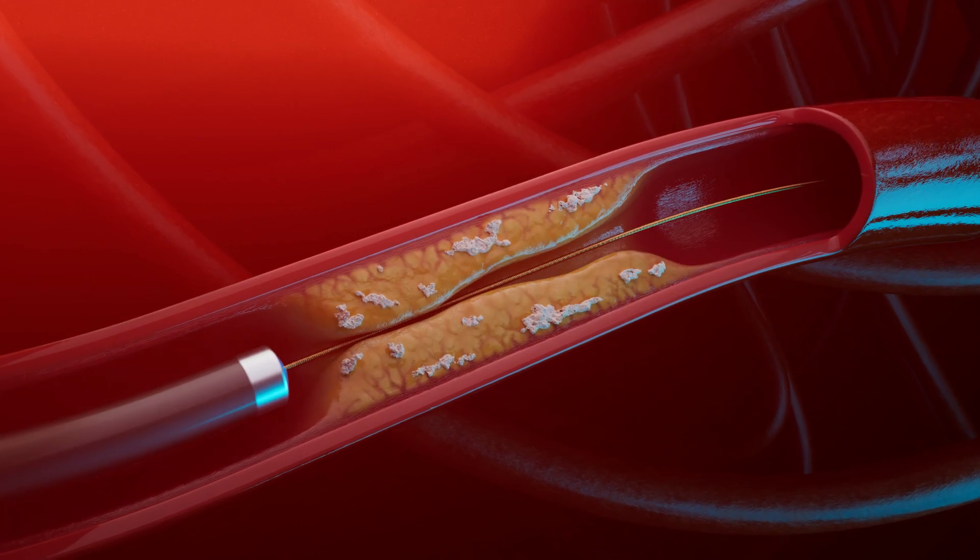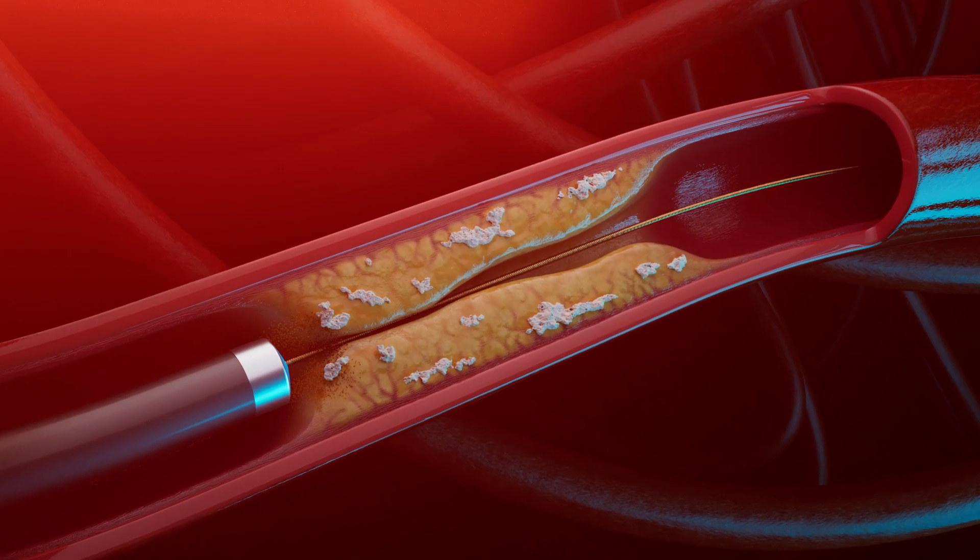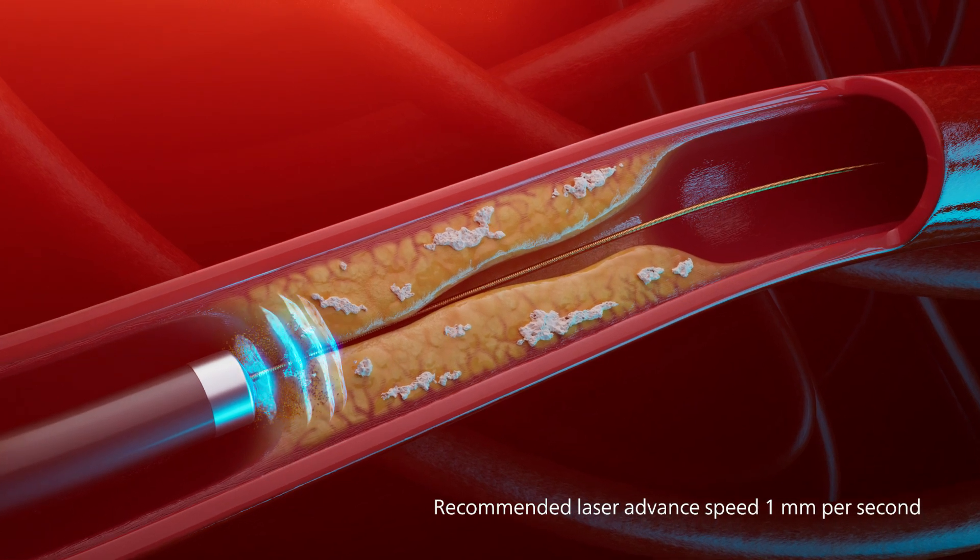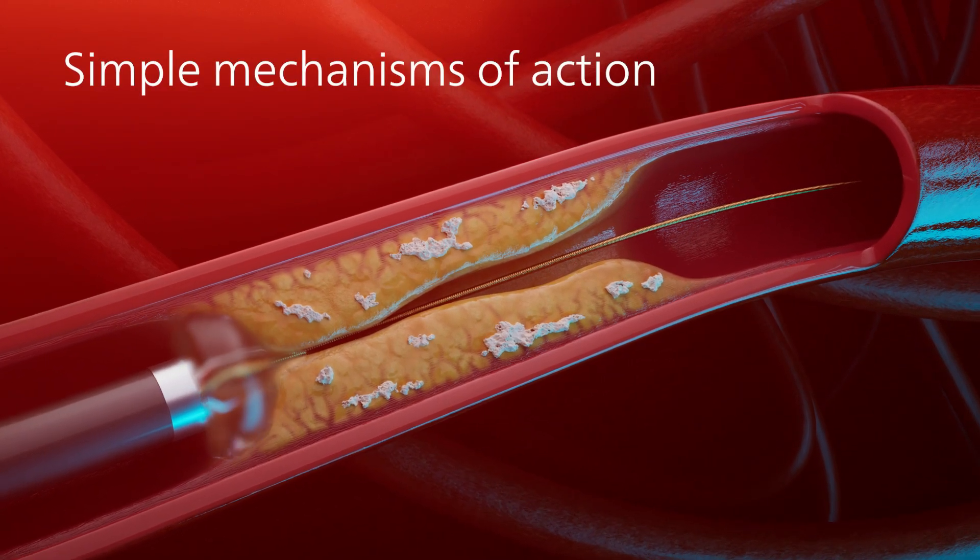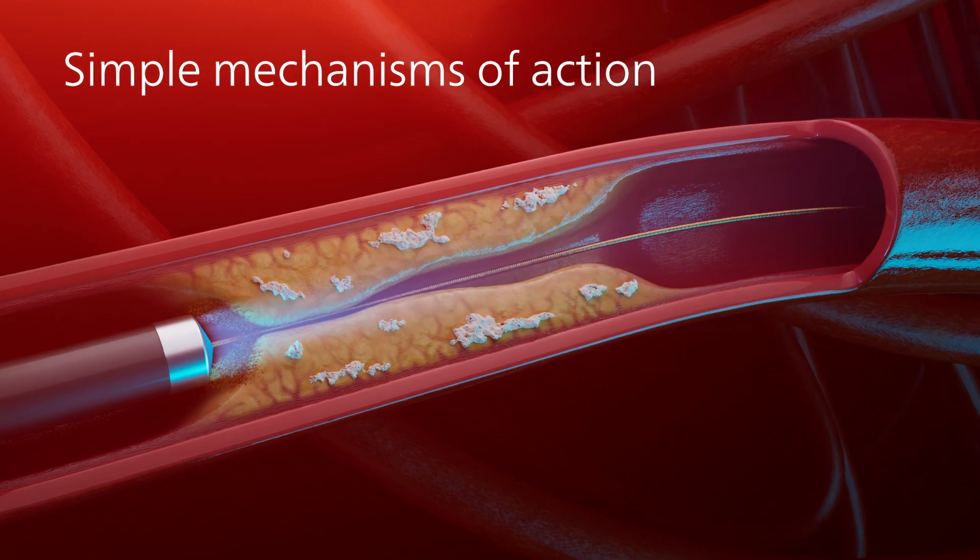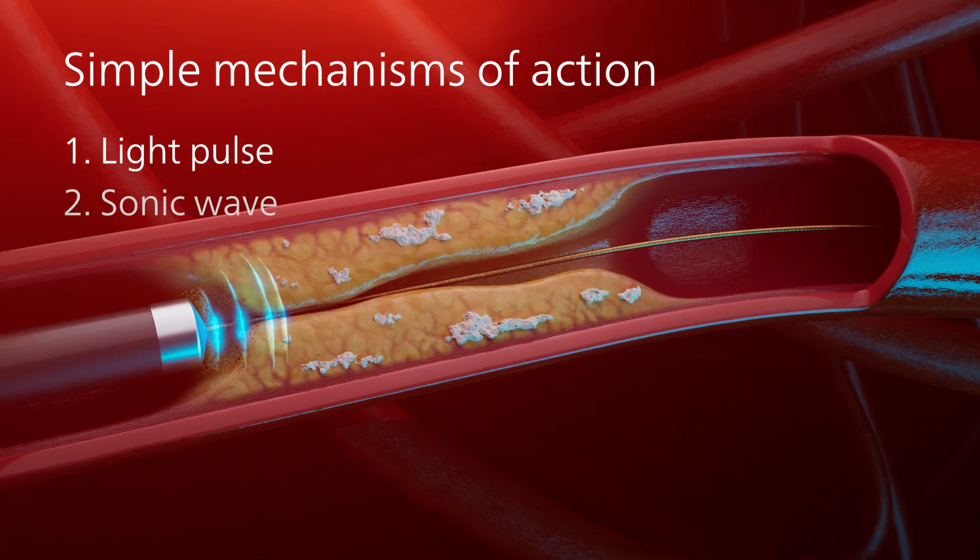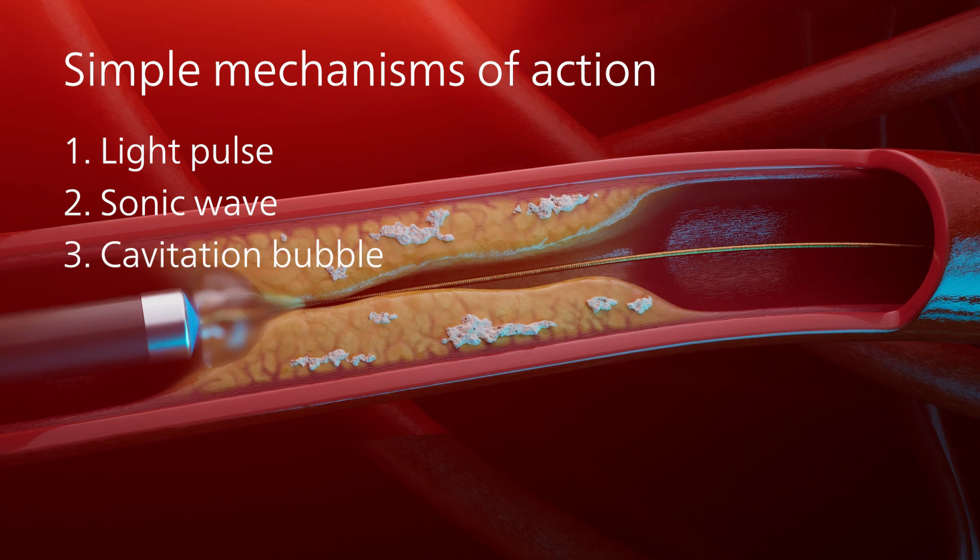The unique photoablation properties of the excimer laser technology safely improve vessel compliance. This is accomplished by three simple consecutive mechanisms of action: light pulse, acoustic wave, and cavitation bubble.